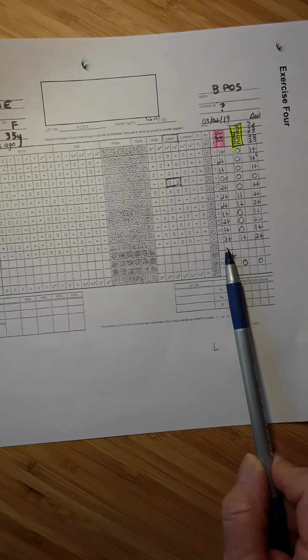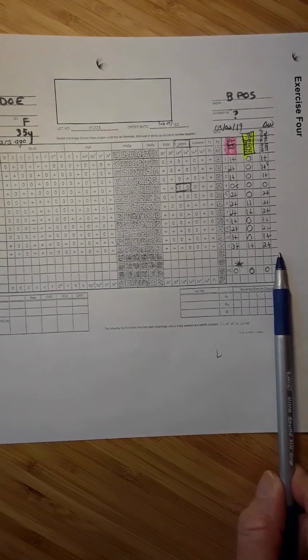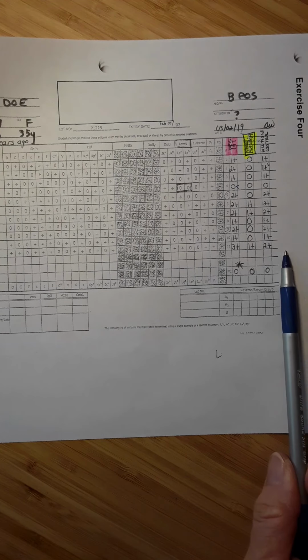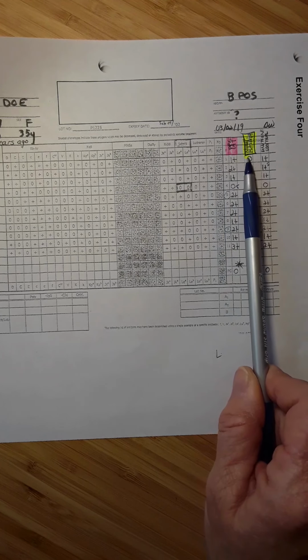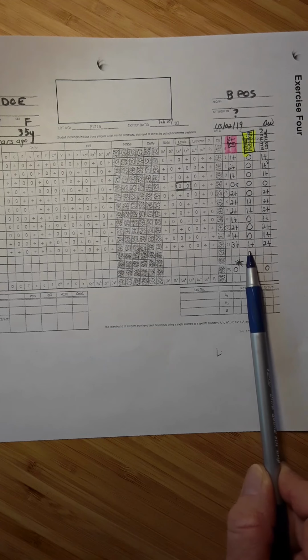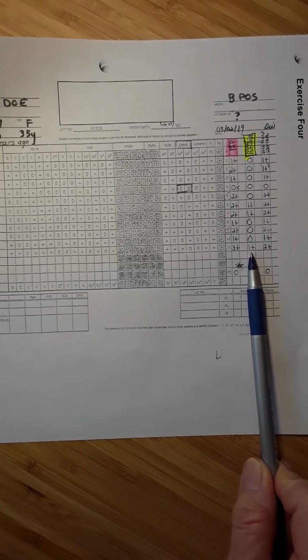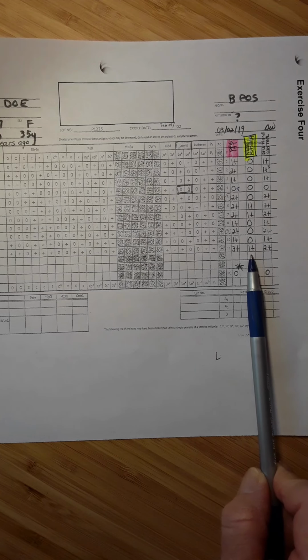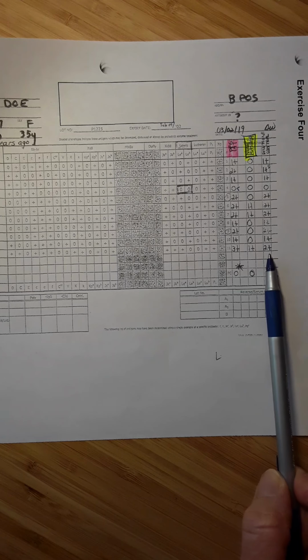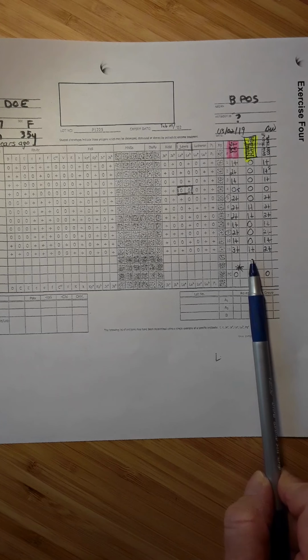Lewis antibodies. The last column on this page is the dilution control. And as lab techs tend to do, we worry. What we worry about is when we created this neutralized plasma, we took patient's plasma and added some drops of the neutralizing substance. And the thought was, well, maybe just adding drops of something else has not neutralized, but rather just diluted out that original antibody. So a dilution control is just that. It controls for the dilution that was used to make the neutralized plasma.